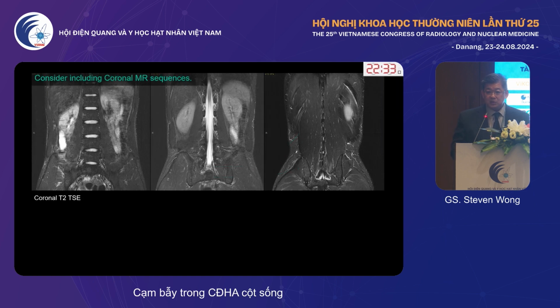If you can, especially for scoliotic spine, do a coronal T2 sequence. Some hospitals like T1s. I have no problems with that, but I like T2s so that you can look at the nerve roots as they come down the spinal canal and as they exit the spinal canal.